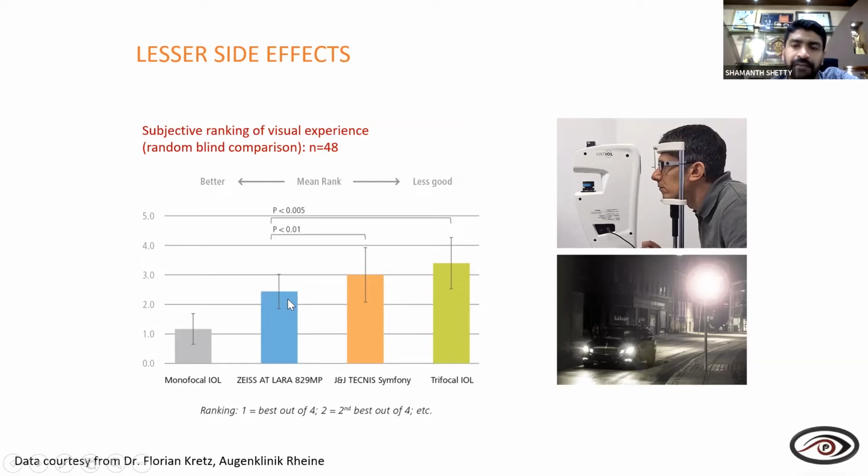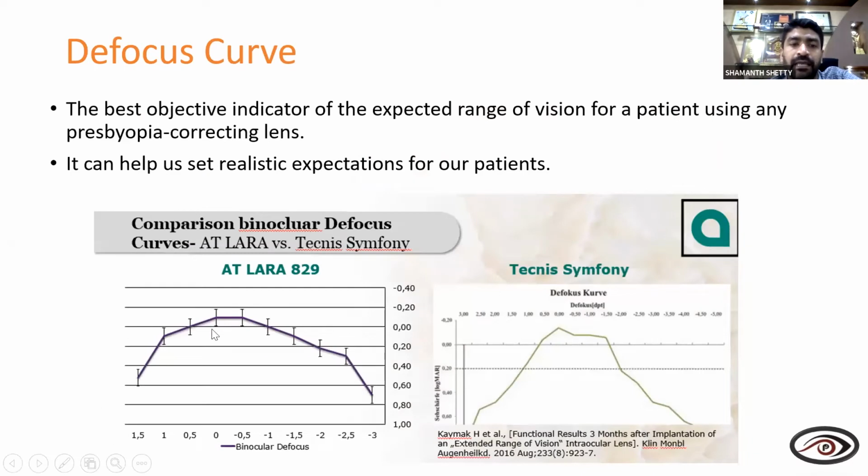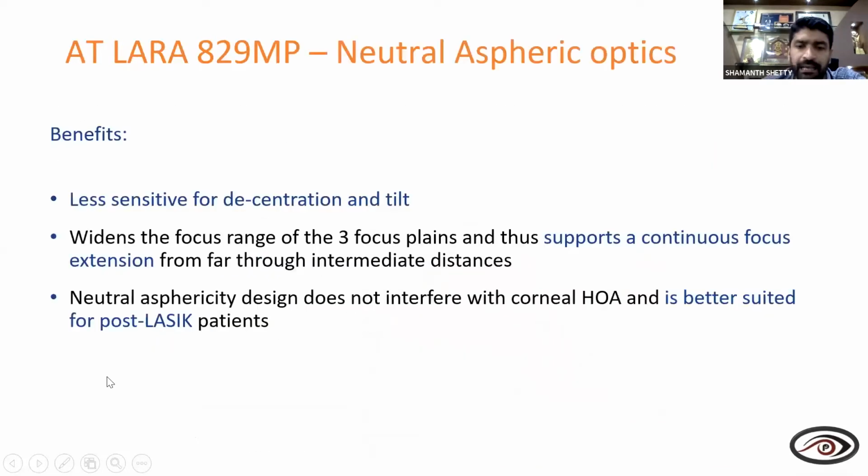EDOF does have some kind of side effects, but it's way lesser than the others. And coming to spectacle independence, like I said, this probably is an exaggerated number. It's almost about 40% of people who say I just don't need glasses, but more than 50% say yes, they need glasses. The defocus curve being flatter as compared to other lenses, the binocular defocus curve being flatter, shows that the kind of vision they have has fewer hassles.